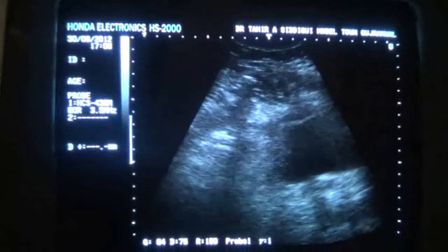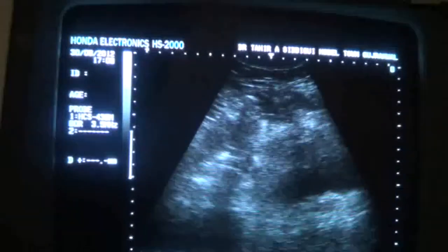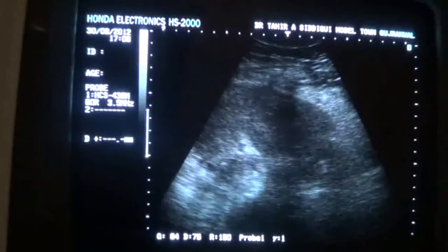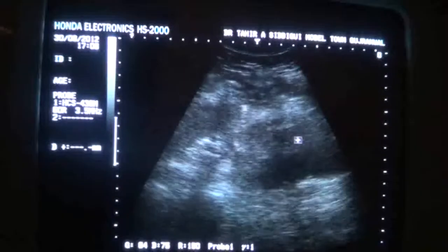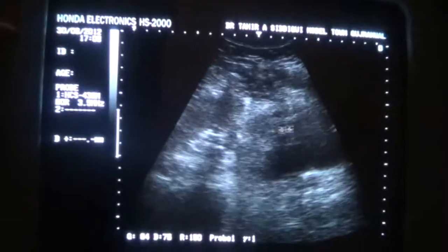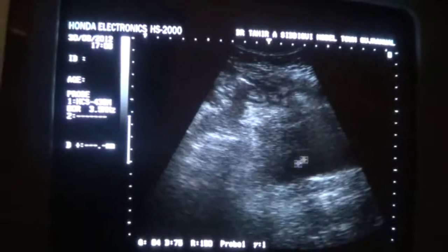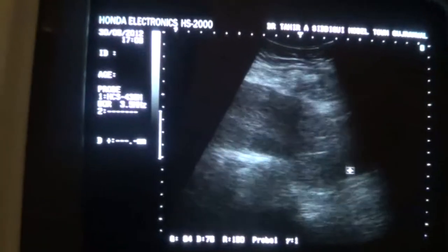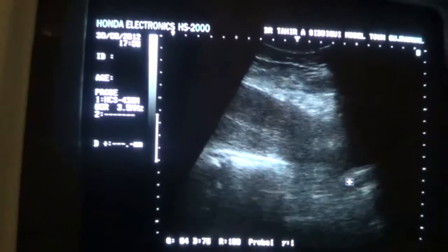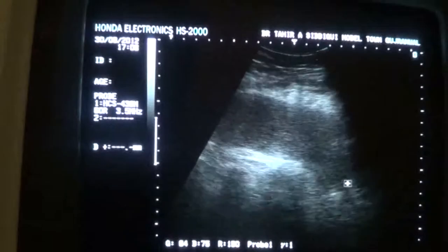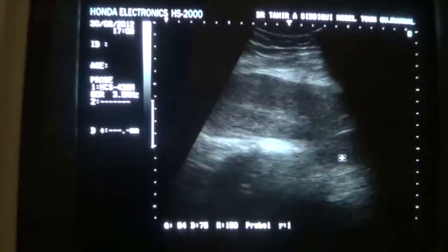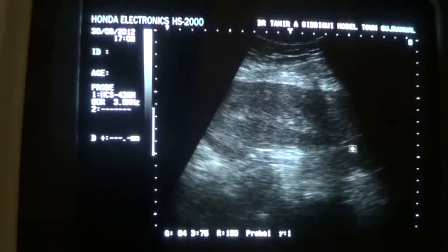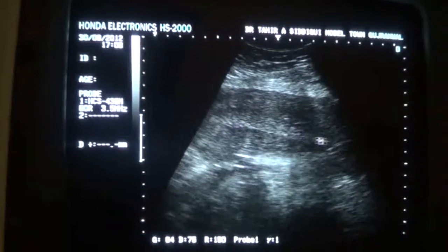This is video segment 2. We are looking at a 4 days postpartum uterus. This is the urinary bladder. This is a longitudinal section, and this is the uterus. This is the endometrial canal.